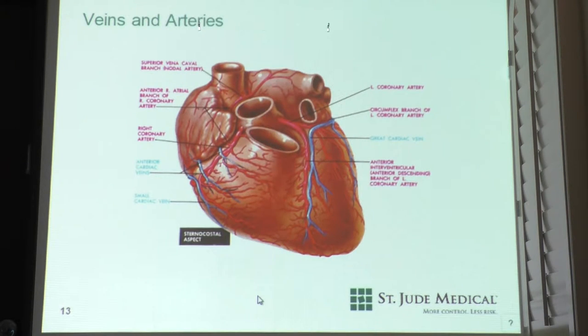So in EP we primarily deal with the blue part, right? The return flow. And specifically when we're putting in BIV systems or CRT devices, if Tony talked about those, what does CRT stand for?